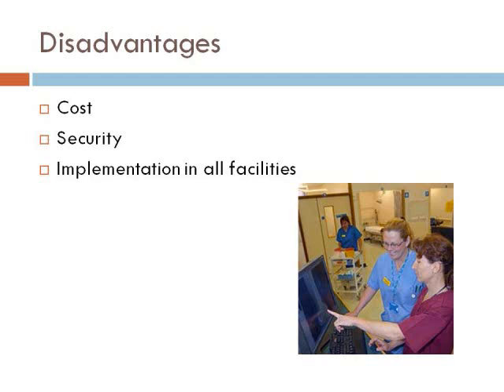Another disadvantage is the security issue, just the fact that we do not want everybody to have access to a patient's images. There's always the protection of the patient's privacy and their records, so it's important to ensure that only the people involved in the patient's care have access to the medical images that may be taken.